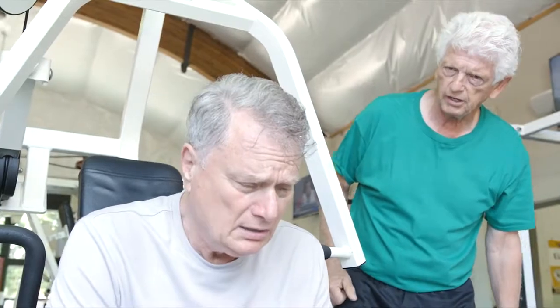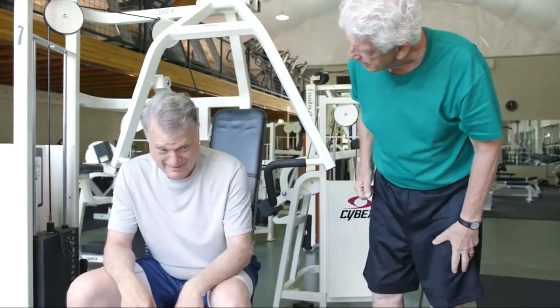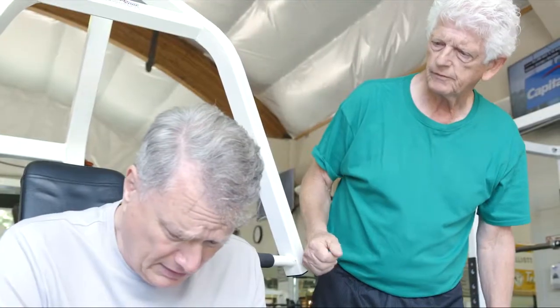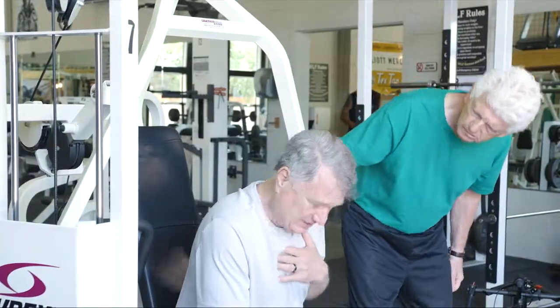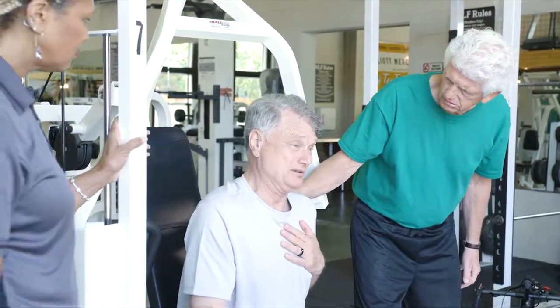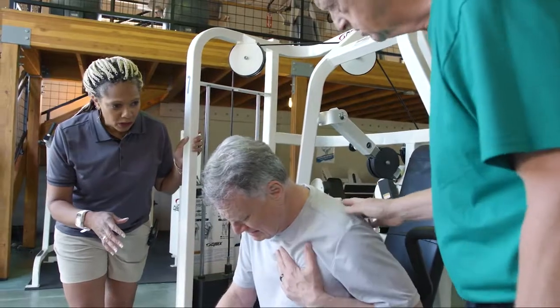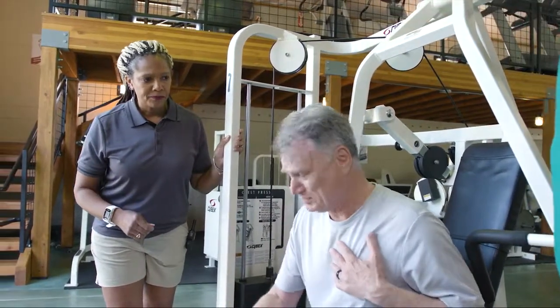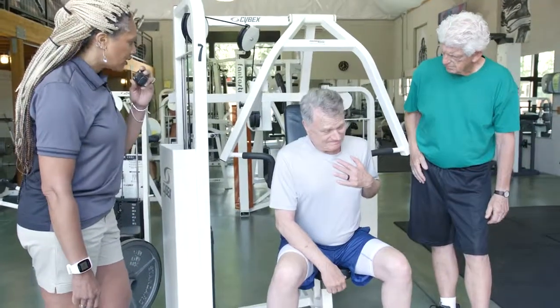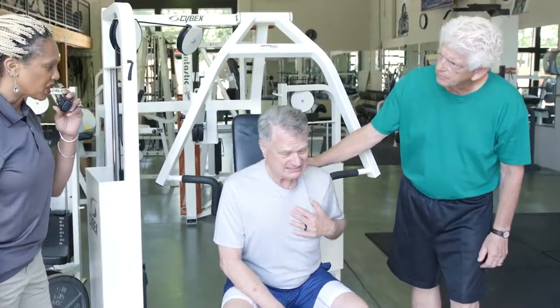Larry, are you okay? I don't know. Are you sure you're all right? Yeah, there just must be something going around. Do you want me to call someone? I'm trained to help. It's my chest. It hurts a little bit here. This is Joelle. Call 911. We have a member with chest pain.